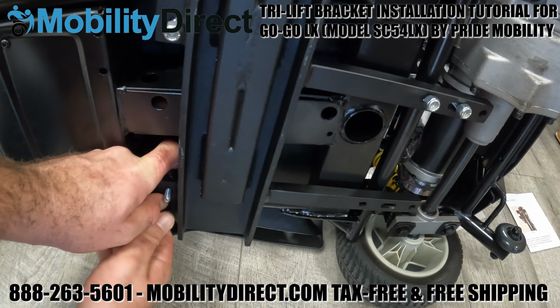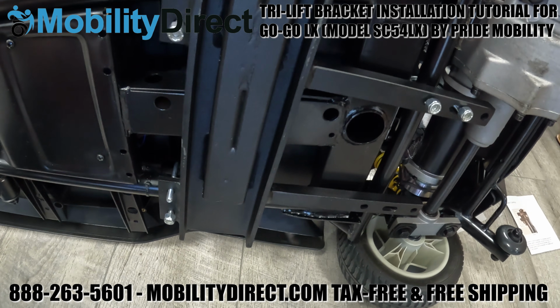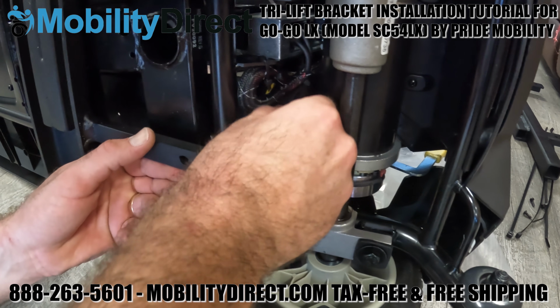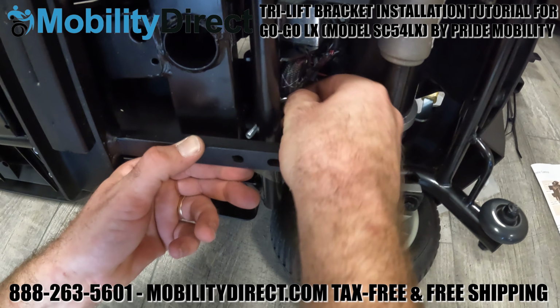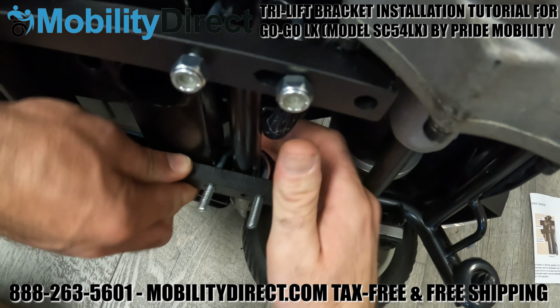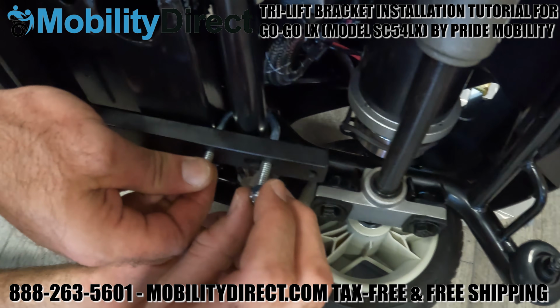There is very little room to get those U-bolts in, but go ahead and work with it until you get all four of those U-bolts in to the same location around the same bars that you're seeing here on this video. So two go in the rear on the main bar that's used to disassemble the scooter.